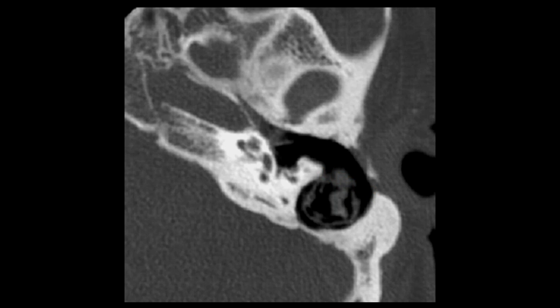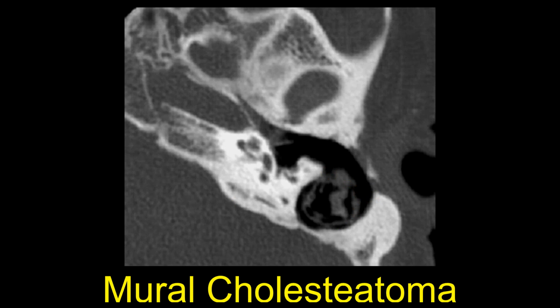And he said, no, we've actually never done surgery on this patient. And I said, no, I'm looking at the imaging. He has had surgery. And the surgeon corrected me and said, no, I know the patient and I've talked to them. They have never had surgery. And this was actually a cholesteatoma of the external auditory canal.